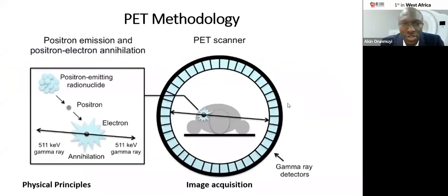So this picture just explains all I have said. There's a positron emitting radionuclide that emits two photons that are released in opposite directions and are detected at the same time by a scanner. So the scanner is what detects it. The PET itself is not radioactive. It's the patient that is radioactive, but the CT component now makes it useful for localizing specifically where the emission happened.